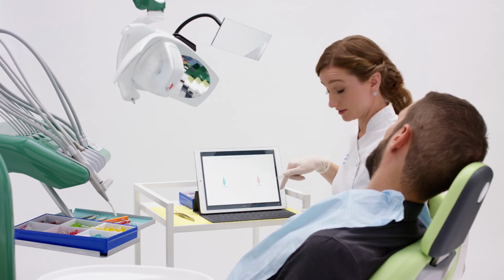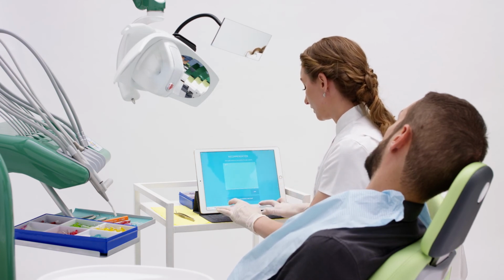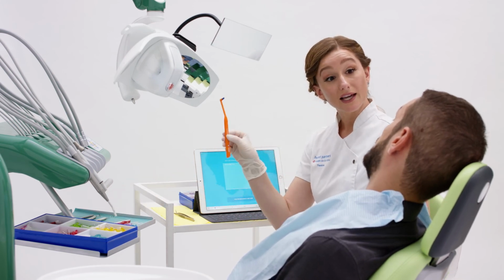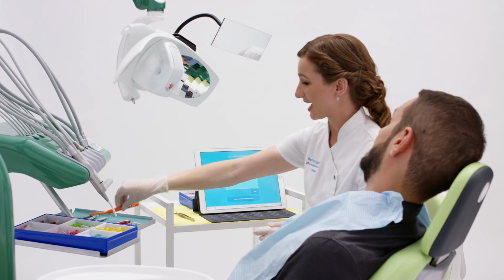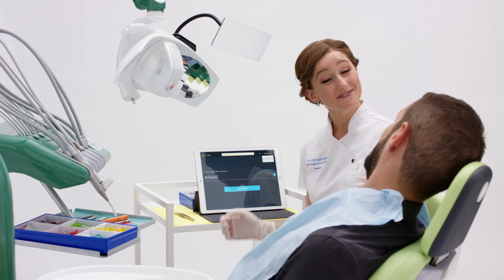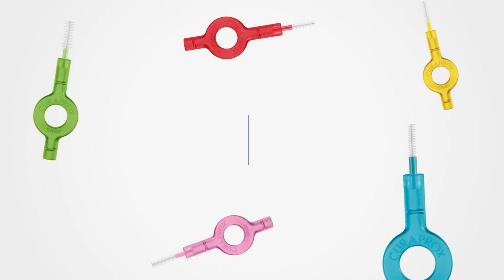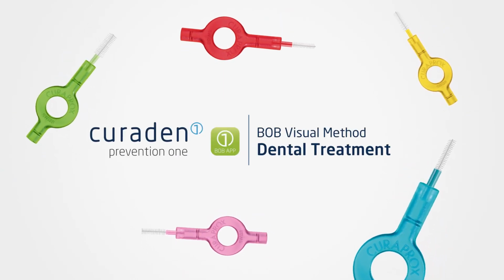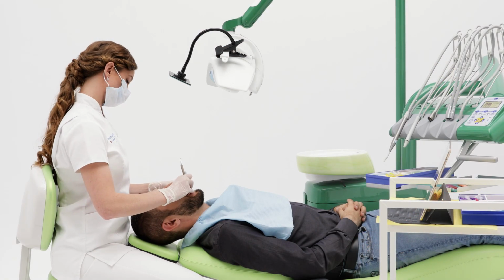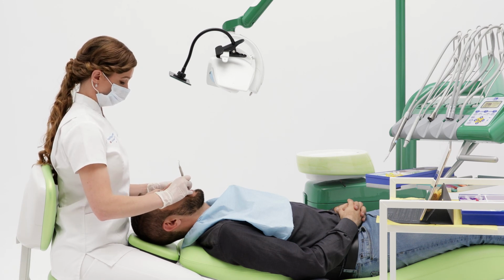The interdental brushes are recommended for him at this time, and I then make a note in the comment section to give him a reminder when he gets home. The comment I make is that the grey circle on his mouth map indicates the use of the single tufted brush in that region. I then save, close this Bob session and send the patient his Bob score, which he will receive via email. It is now time to complete the patient's dental treatment, and in my case here, I will finish my Bob Visual method with the dental hygiene cleaning.